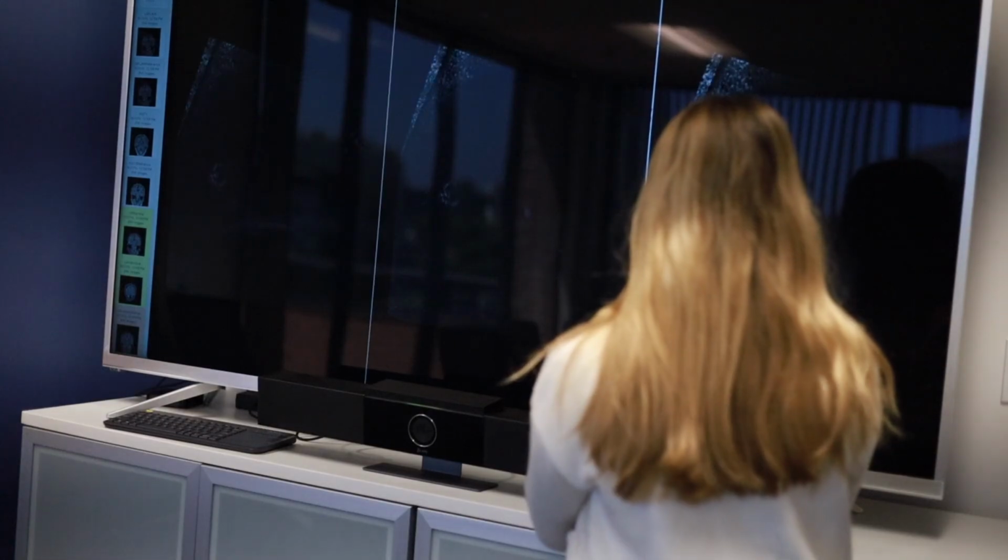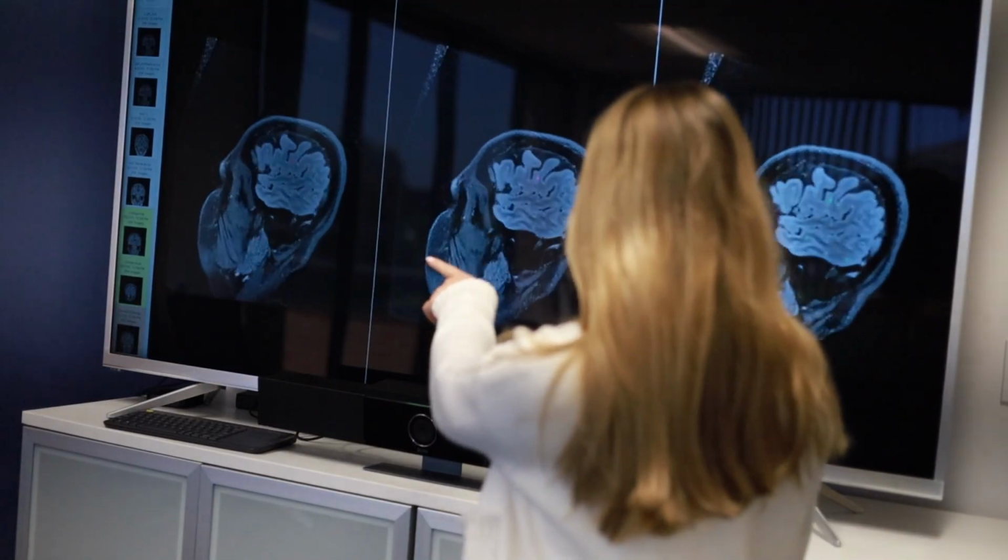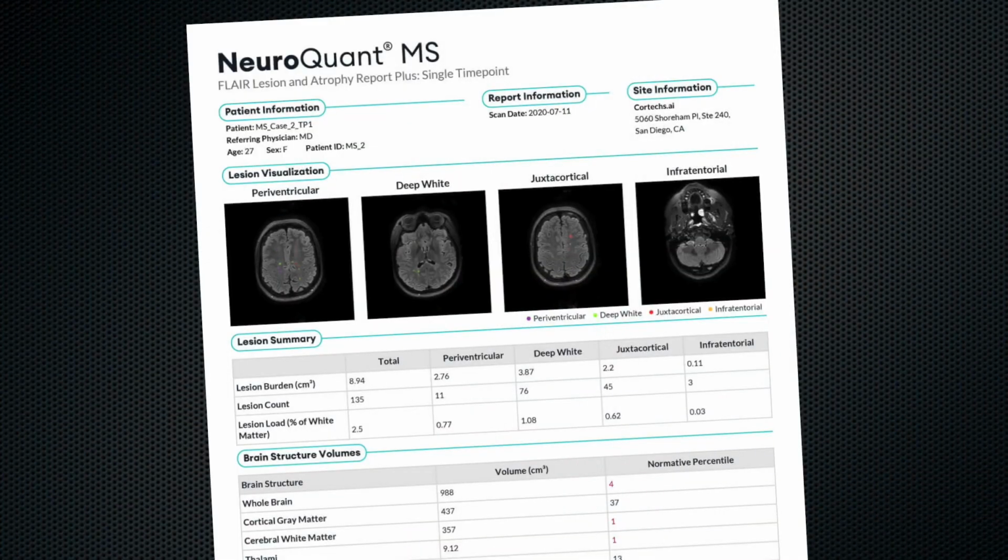I've been using it in my clinical practice for about 8 years for MS, and there has been a tremendous difference in the accuracy of the segmentation over time, because now we incorporate deep learning as opposed to just machine learning, and it really helps to identify subtle plaques that might be infratentorial in location. We use 2 input sequences, the 3D-T1 for the volumetrics, and a FLAIR sequence, ideally a 3D FLAIR. Over time, plaques that are new or enlarging will be red, shrinking plaques will be blue, and everything's laid out for you in your report.